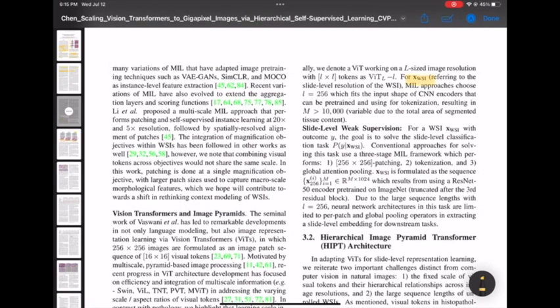For a large whole slide image, the number of patches and thus the token sequence length can be larger than 10,000. This makes standard self-attention intractable. Every token cannot attend to all other tokens, and if we use larger patches to decrease the sequence length, we will simply miss details in the image. This loss of detail will degrade performance.